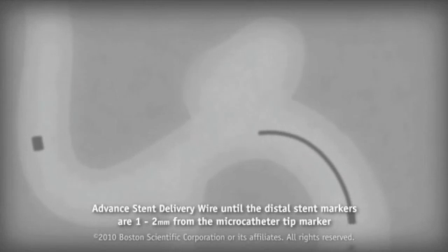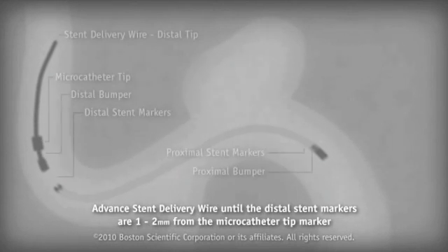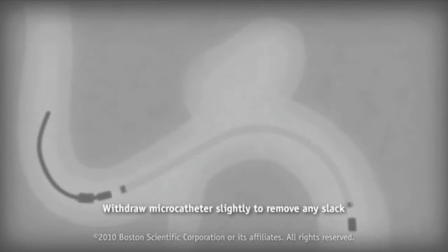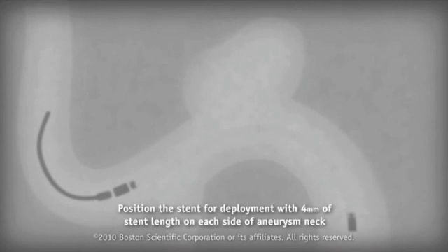Under fluoroscopy, advance the stent delivery wire until the distal stent markers are 1 to 2 mm from the microcatheter tip marker. Withdraw the microcatheter slightly to remove any slack. Position the stent for deployment by aligning the stent markers across the aneurysm.